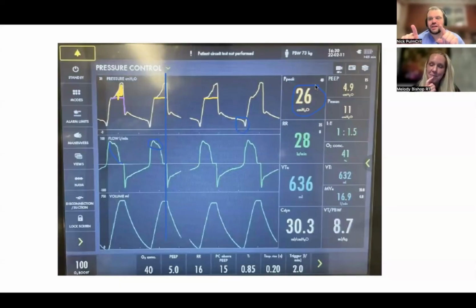And so I'm going to use that opportunity to bag on PRVC, because that's exactly what PRVC doesn't allow you to do. It just applies its dumb algorithm to a patient that's floundering, and like you said, you take away the dumb ventilator and see what the patient's doing. Then from that, it's like, all right, they're breathing like 20, so this is 28. They probably want to go faster, right? Because of your delayed cycle, they want to go faster, or they want more breath, or a bigger volume or something, right?